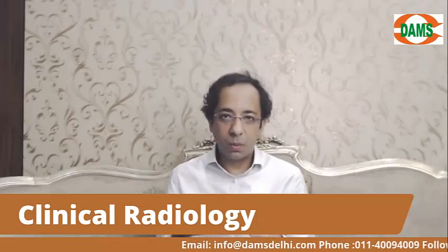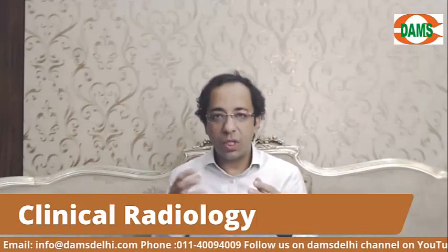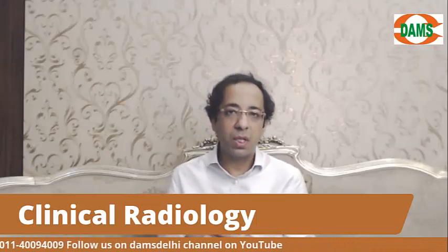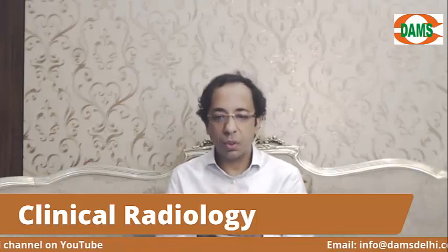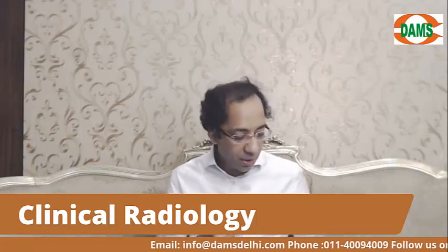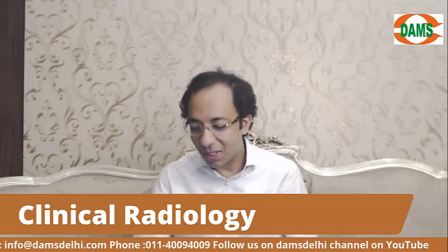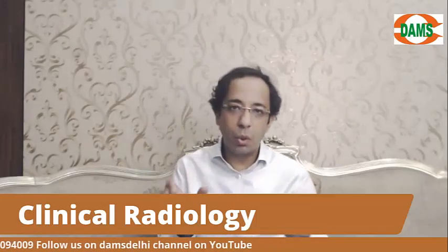I got a lot of students sending me messages: "Sir, we need to know radiology before we start doing the clinical subjects also, because images are a part and parcel of what we are doing in our routine clinical lives." So let's get started. I can see all of you. Yes, I can see all of you. So let's start looking at things.